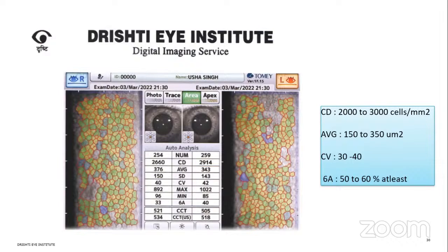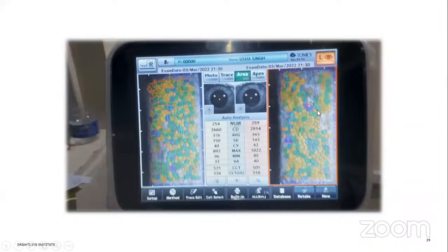In the specular microscope, definitely we can see the changes also, ma'am, but it will be more evident in confocal microscopy, I guess. But definitely, I think we can differentiate between guttata and pseudoguttata, because in pseudoguttata we don't have damage in the Descemet's membrane. So the dot which appears in the center will not be so prominent as seen in guttata. That's what I have read. Okay. I can show you the picture of that.